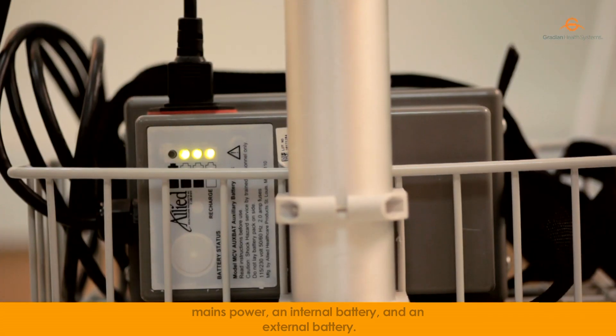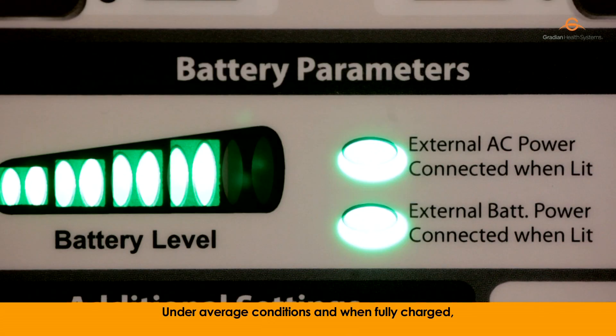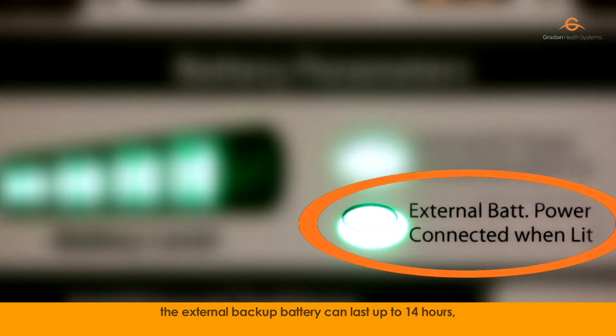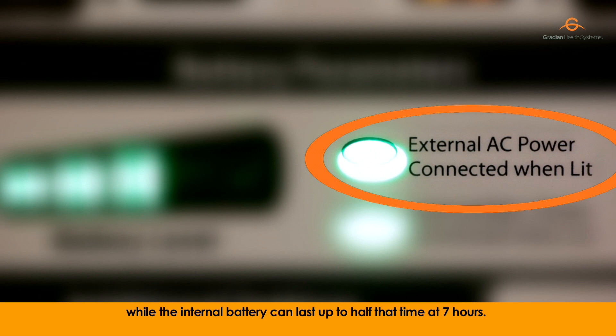and an external battery. Under average conditions and when fully charged, the external backup battery can last up to 14 hours, while the internal battery can last up to half that time at 7 hours.